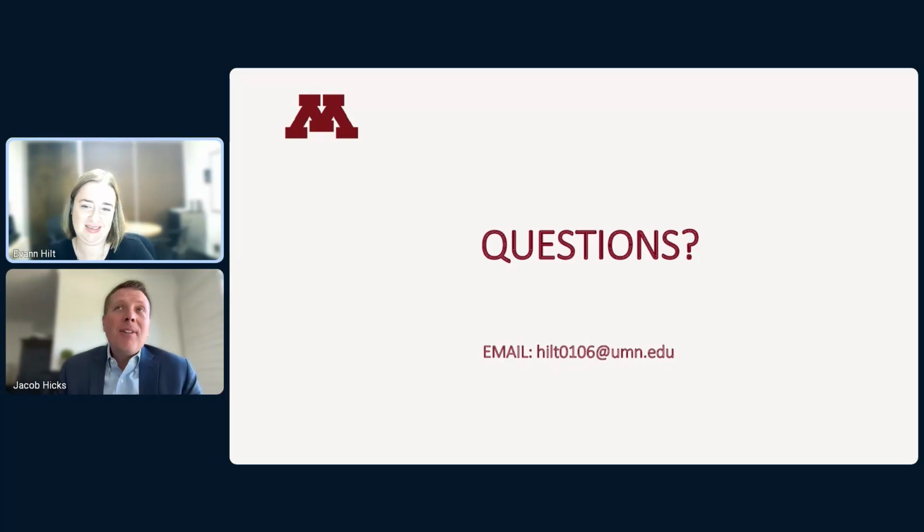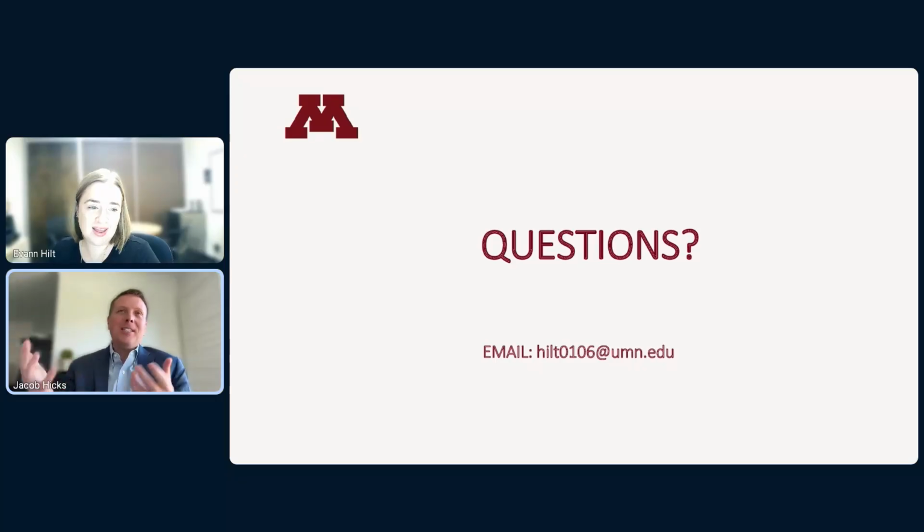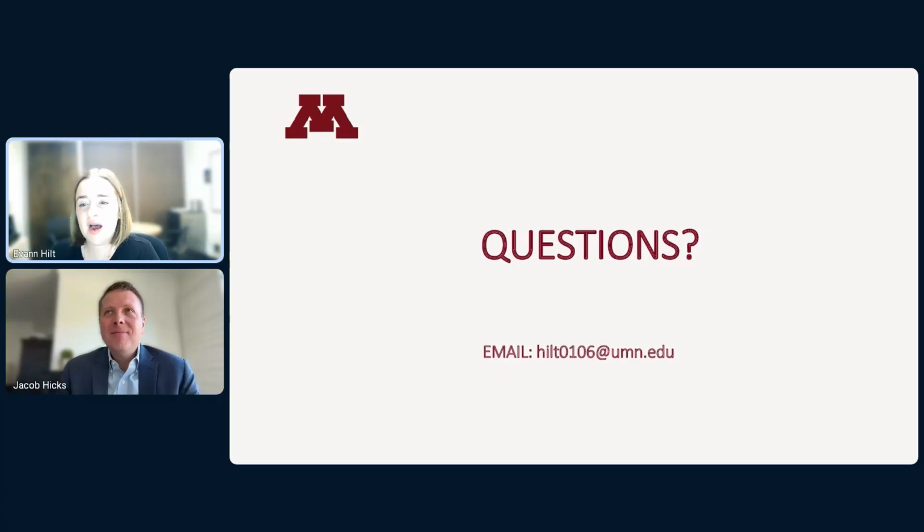Paul asked, do you provide any captured images with the results? The answer is definitely yes, but what would you add around what is presented and potentially captured, Dr. Hilt? Yeah, so the way the technology works is it presents the representative image of what it could be, and it gives a possible identification for that.